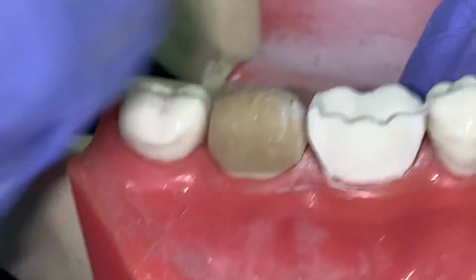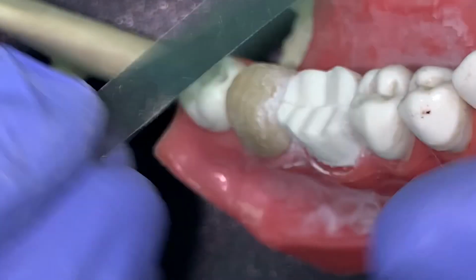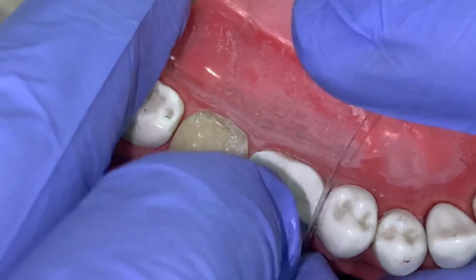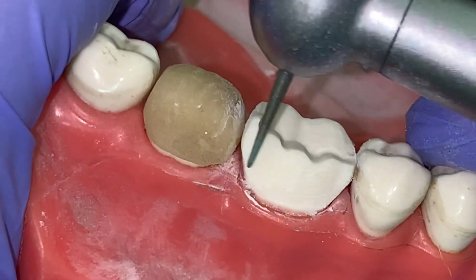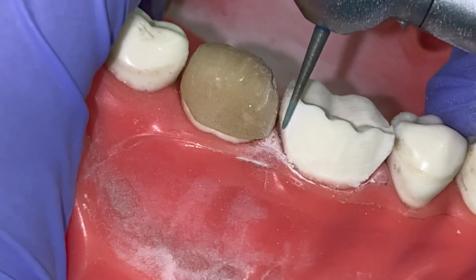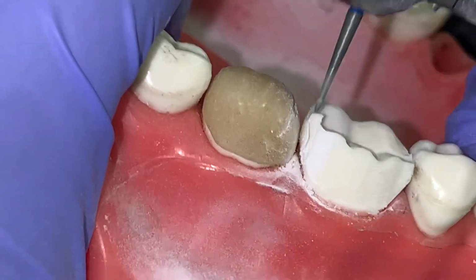So I'm planning to make some proximal cuts here. I have used a very thin burr. Now this is a matrix band that you can also use to prevent slicing the adjacent tooth. So look at how thin the burr is that I'm using right now. What that does is it helps me prevent slicing the adjacent tooth.